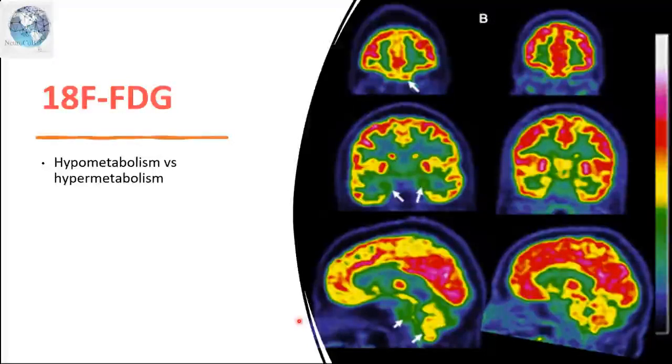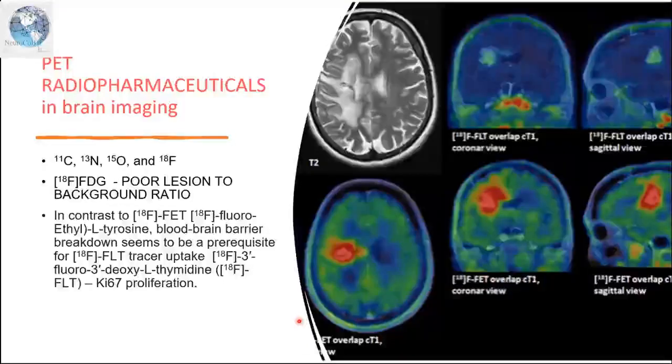You don't just eyeball it, because it can be wrong. It can be normal. Some people are just not homogeneous, right? The whole brain doesn't use the same amount of glucose. So you want to know, is it physiological or is it pathological? This kind of thresholding helps. Many softwares are available depending on the machine you're using. Maybe a Siemens machine will have their own software, GE will have Cortex ID, and then we have Neurostat, which is vendor independent. So there are many different software.